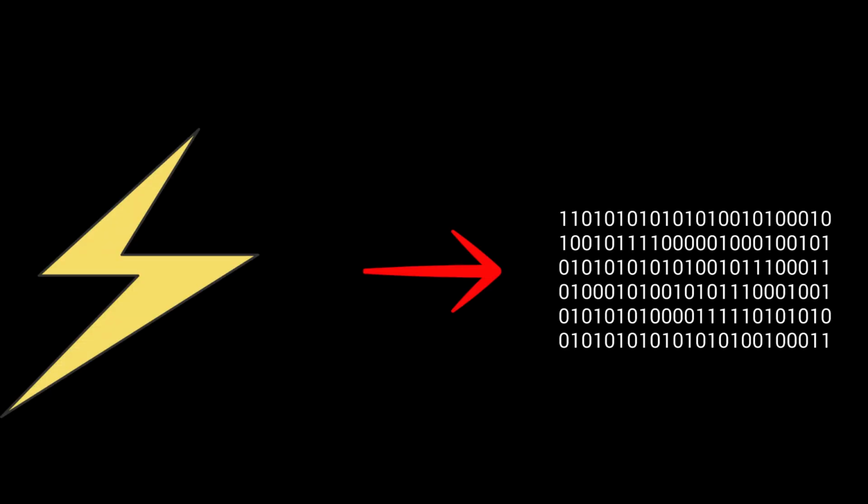Once the charge from each DEL is collected, it's sent to an ADC, the analog to digital converter, as we talked about. This ADC converts the electrical charge into digital signals, which is ones and zeros, the binary code, for the computer to build the image. There's no intermediate step, no light emission, no photodetector, just straight from X-rays to electrons to the digital image. This makes direct DR extremely efficient. It's commonly used in specialties like mammography, where fine detail and low noise are critical.